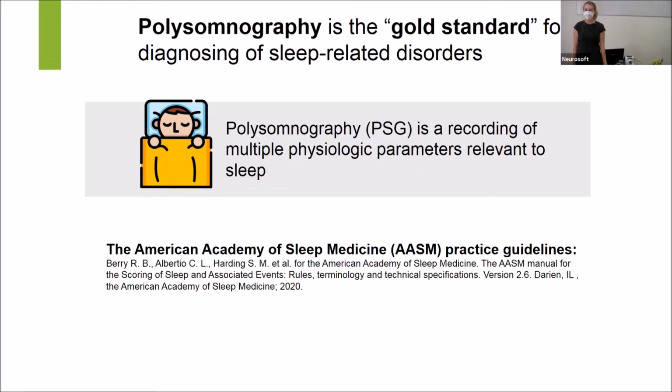It's the second webinar dedicated to polysomnography. Last time I described the different types of PSG tests, and now this webinar is dedicated to the practice of polysomnography. But we start with the term.